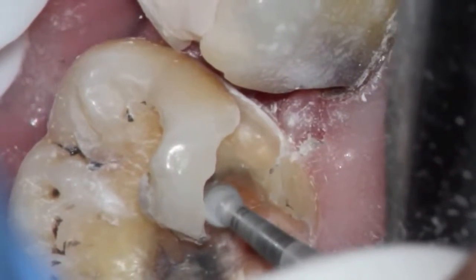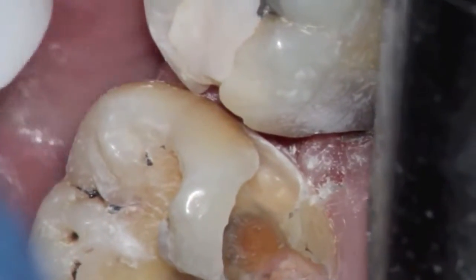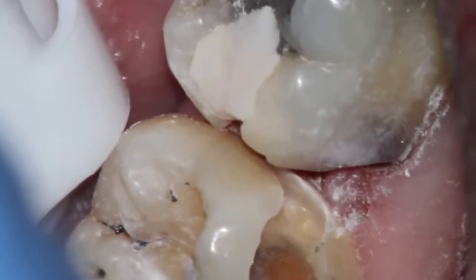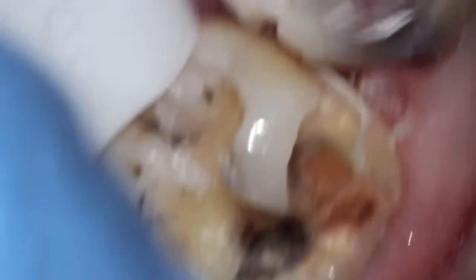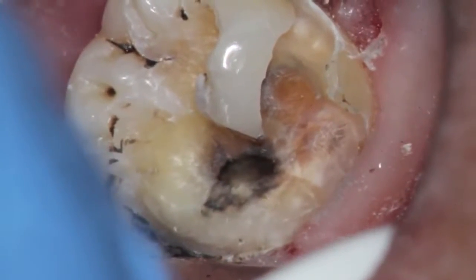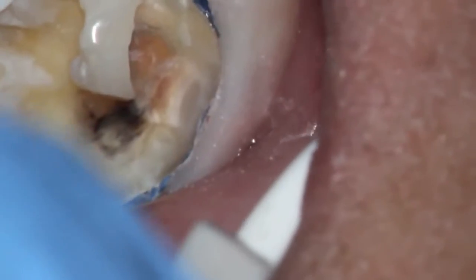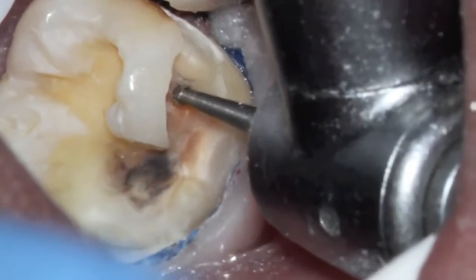You can see the tooth in front of this one. The other molar has significant decay, and that will be the next tooth in the series to try and restore her bite in this area. Patient's about 50 years old and doesn't want to lose any more teeth and is willing to take the risk.